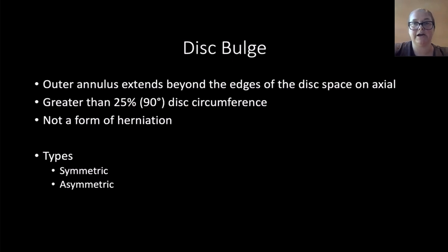So disc bulge, how do we describe a disc bulge? I'll just say one thing. A lot of people still describe disc bulges as broad-based or focal. That was nomenclature, I think, from the earlier lumbar spine paper. In the second paper and the revised paper, they no longer said focal, broad-based. You'll still see it in some reports, but we'll go with what the most recent one is.